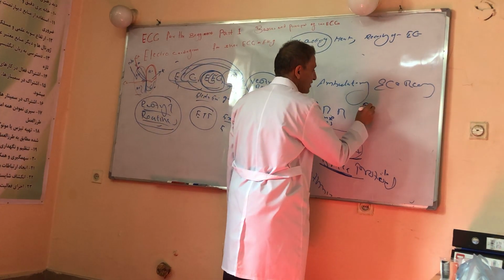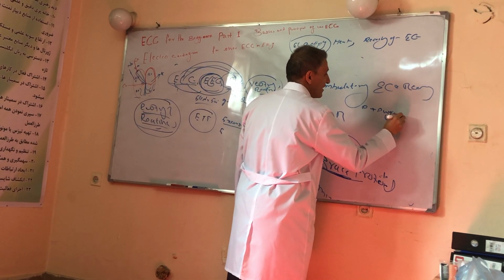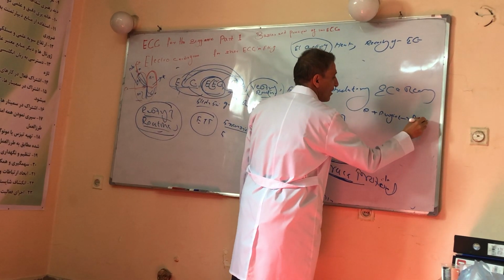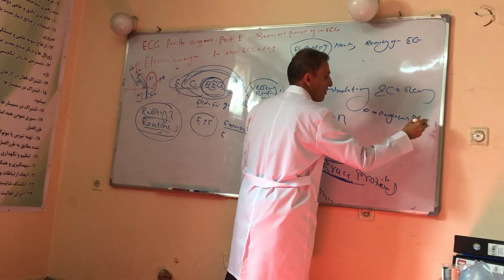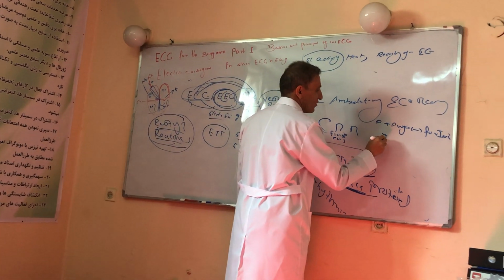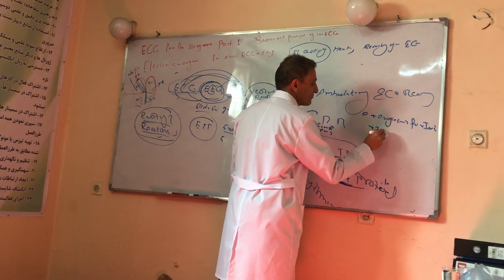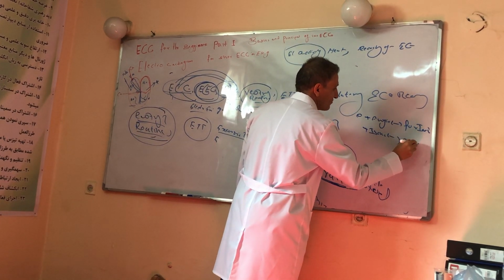Number 1, this test is positive for angina and negative for ischemia. Number 2, this test is positive for ischemia and negative for angina.